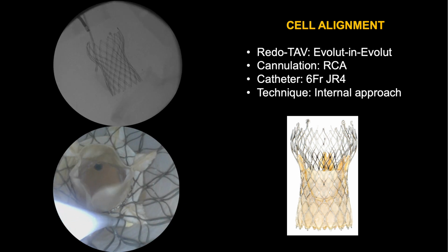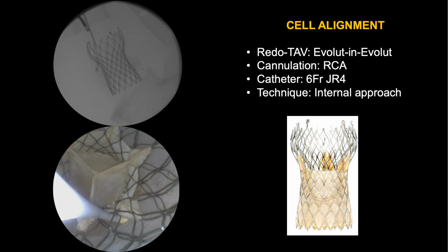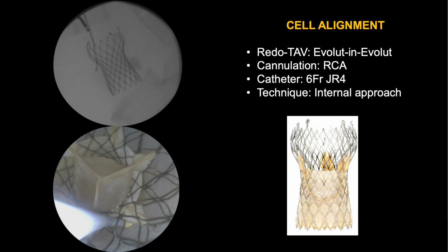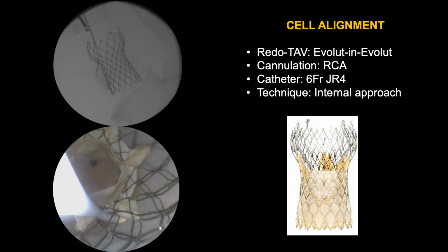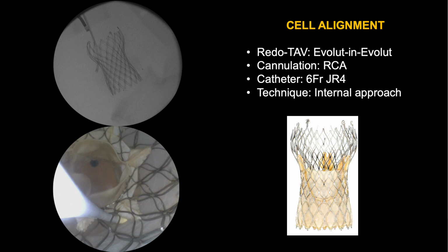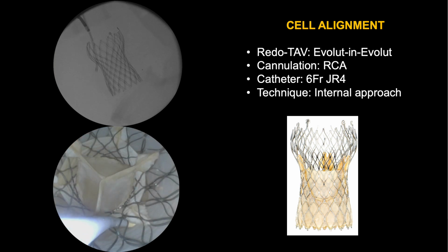Now that's not saying that it's completely unfeasible. You may still be able to fit a catheter, a 6 French catheter, through that gap to enter into the relevant sinus. However, it'd be very difficult to achieve a selective cannulation as you don't have as much movement.